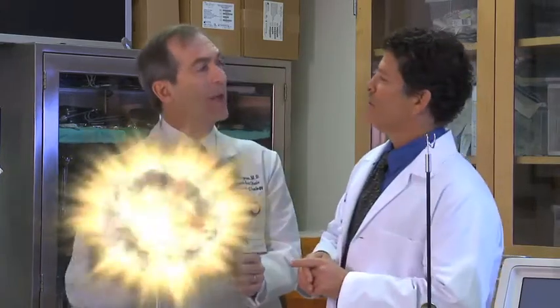It has a 1 millimeter channel, really, really small. And you can take a laser fiber that is 1/4 of a millimeter, pass it through that channel, see it, put it on the stone, and it'll totally dust the stone out, just with light energy. So you're saying it literally melts the stone away. The scope is in there, and you say, hey, we got something, we're going to go get it. Pass the laser fiber up. And then you just see it, and it's all on a TV screen.